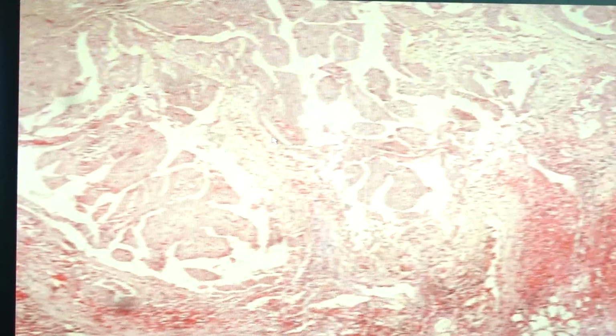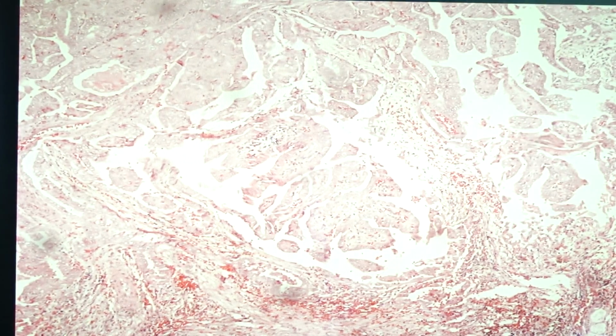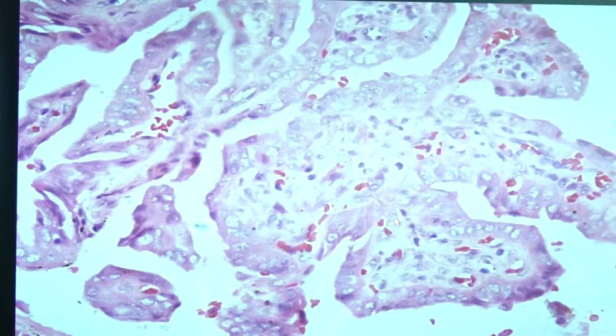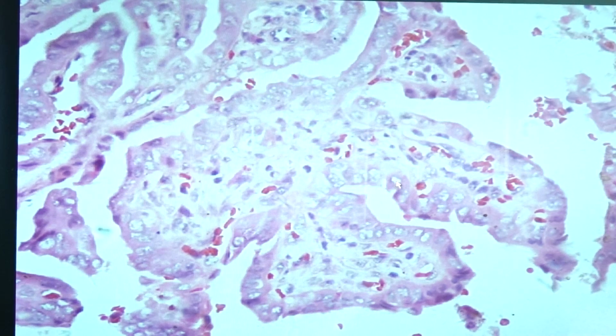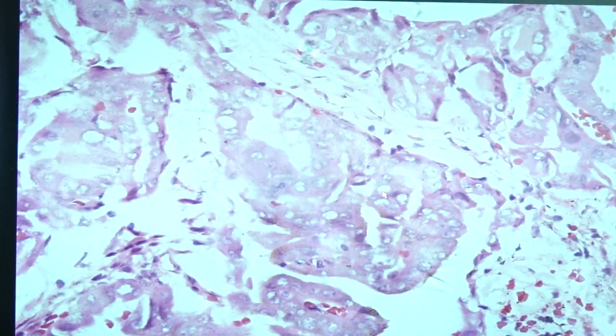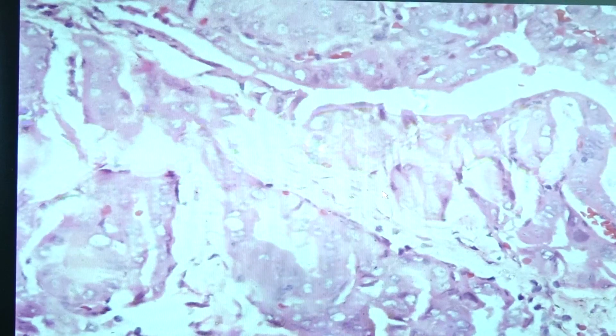Histologically, we would see the presence of the papillae. So you would be able to identify that it's a papillae if it's forming papillary structures, and there's the presence of a fibrovascular core at the center. So this is a papilla with a fibrovascular core, fibrous, and presence of capillaries. So look at the nuclear feature of the cells.